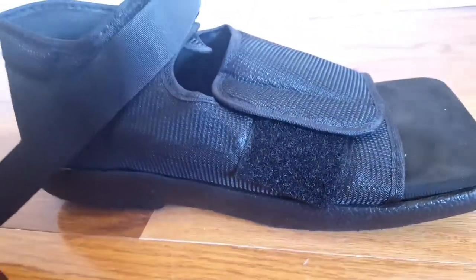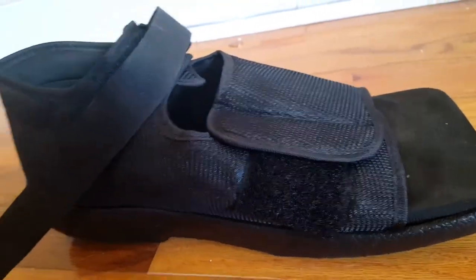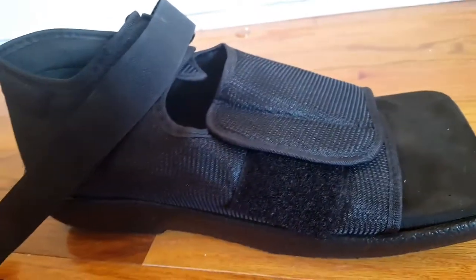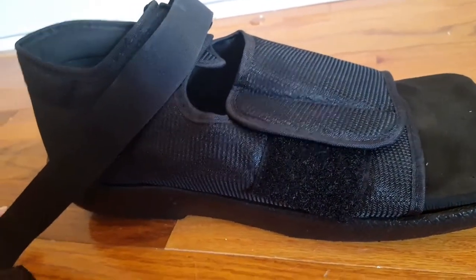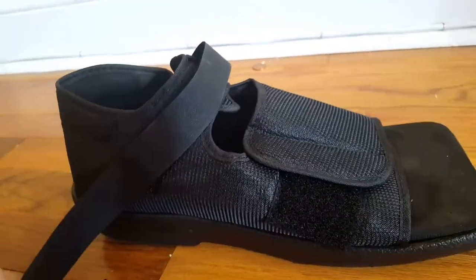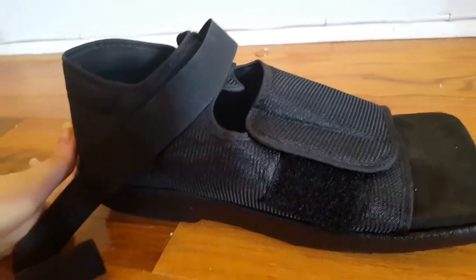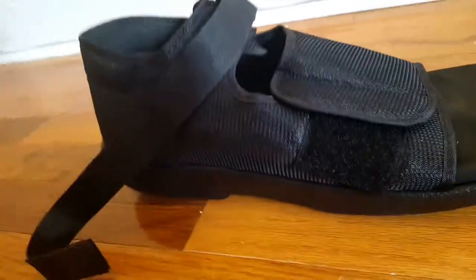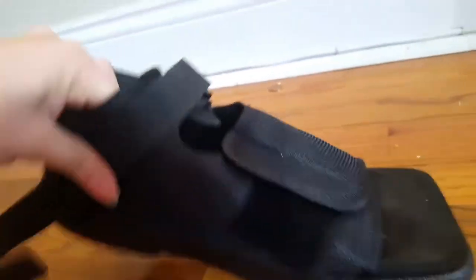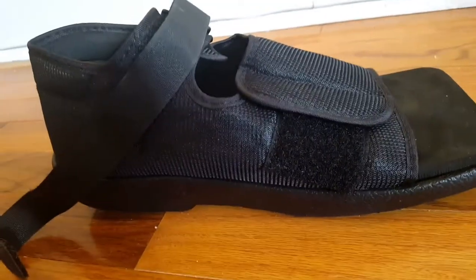I recently fractured my toe — it's quite a long story — but basically the doctor told me I had to wear something that kept my foot flat. They had one there for me to try on but it was too big. It looked something similar to this, but since that one didn't fit they sent me home with a full-on walking boot cast, which was really uncomfortable. So I decided to just order one that looks like this, and this does the trick.